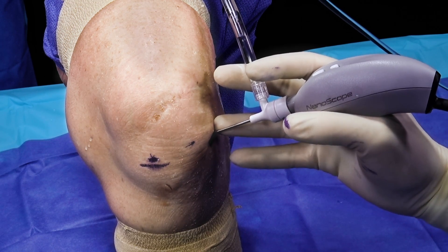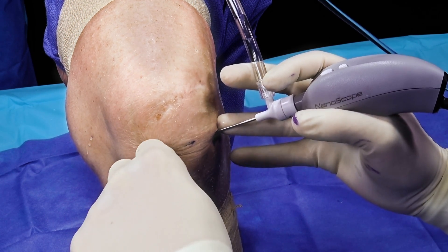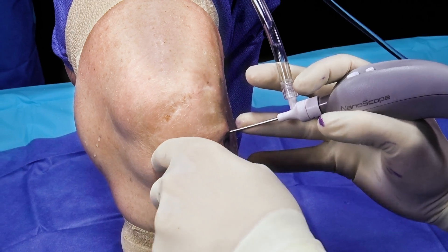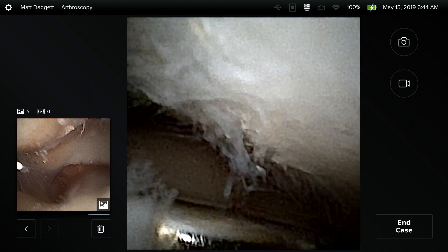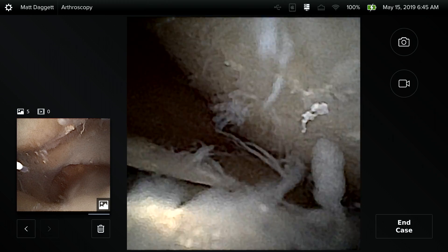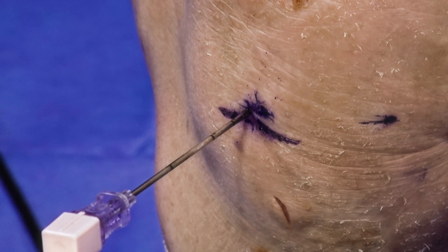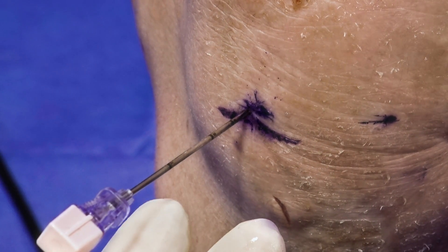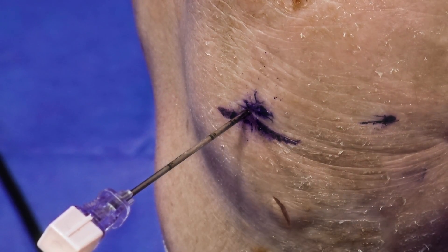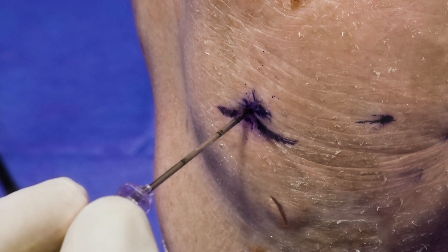Next we're going to establish our working portal. We take the graduated spinal needle and insert it, visualizing it upon entrance. The graduated lines on the spinal needle allow us to identify the depth and appropriate cannula selection for the nanoarthroscopy portal. We have markings of seven, five, four, and three that give us the depth of trocar we should utilize. In this situation, we're going to be utilizing the three trocar cannula.